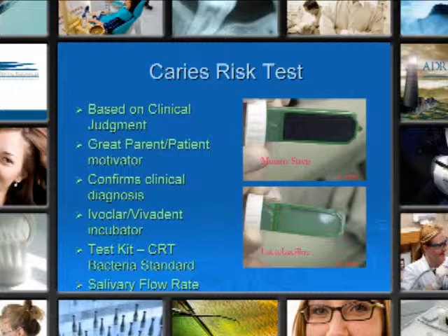You can purchase the product from Ivoclar Vivadent. You need an incubator and these individual tests. It also allows you to measure salivary flow rate.